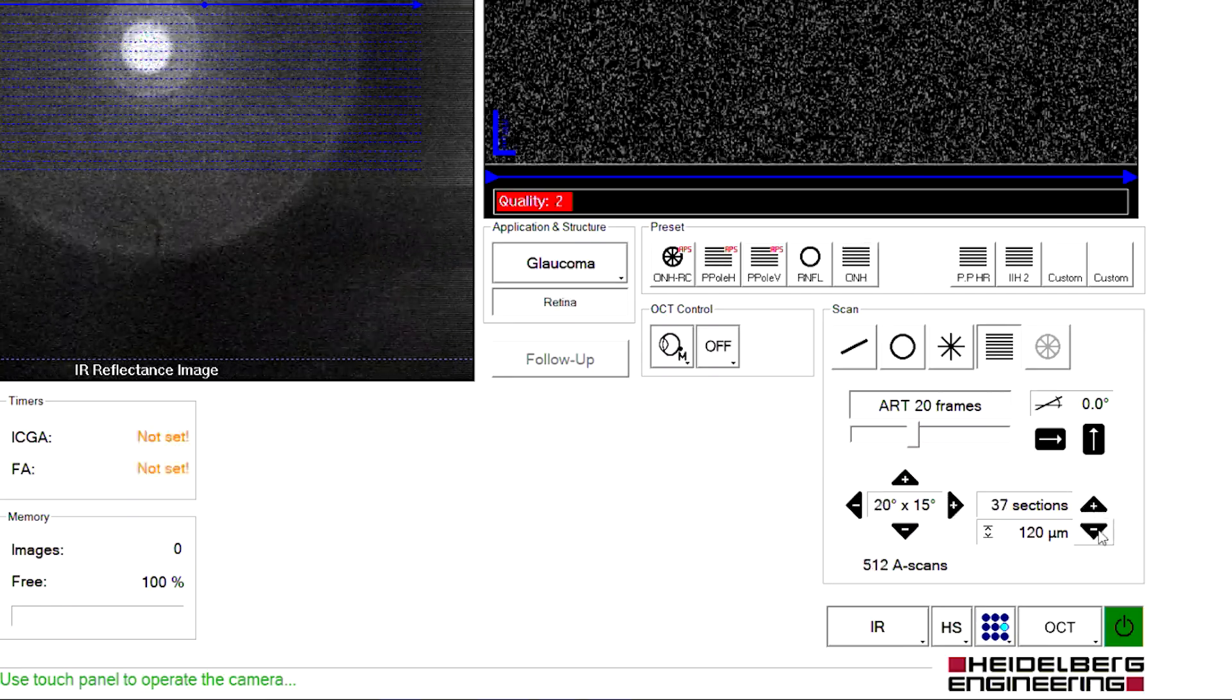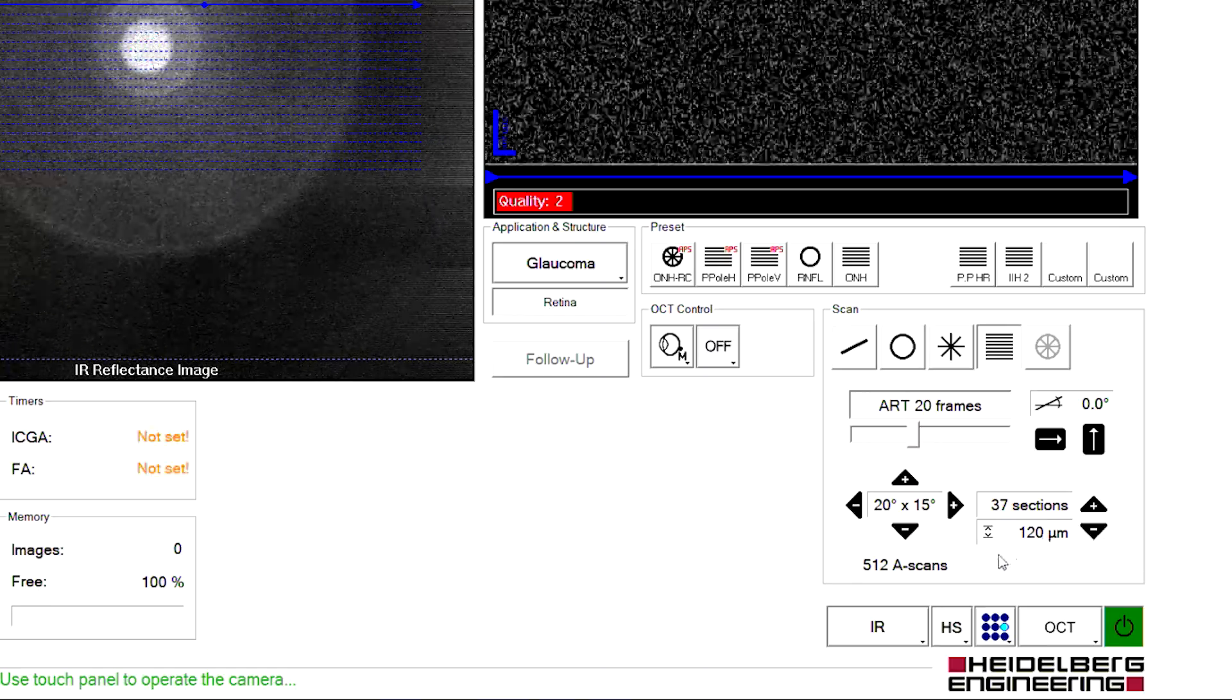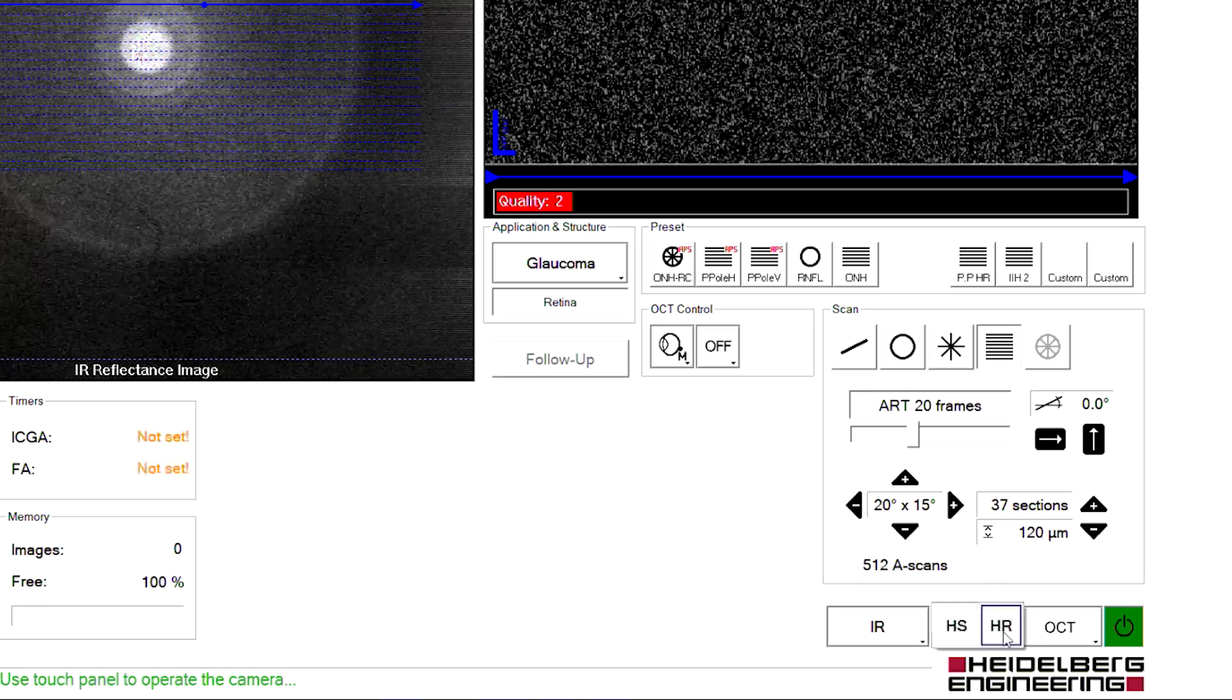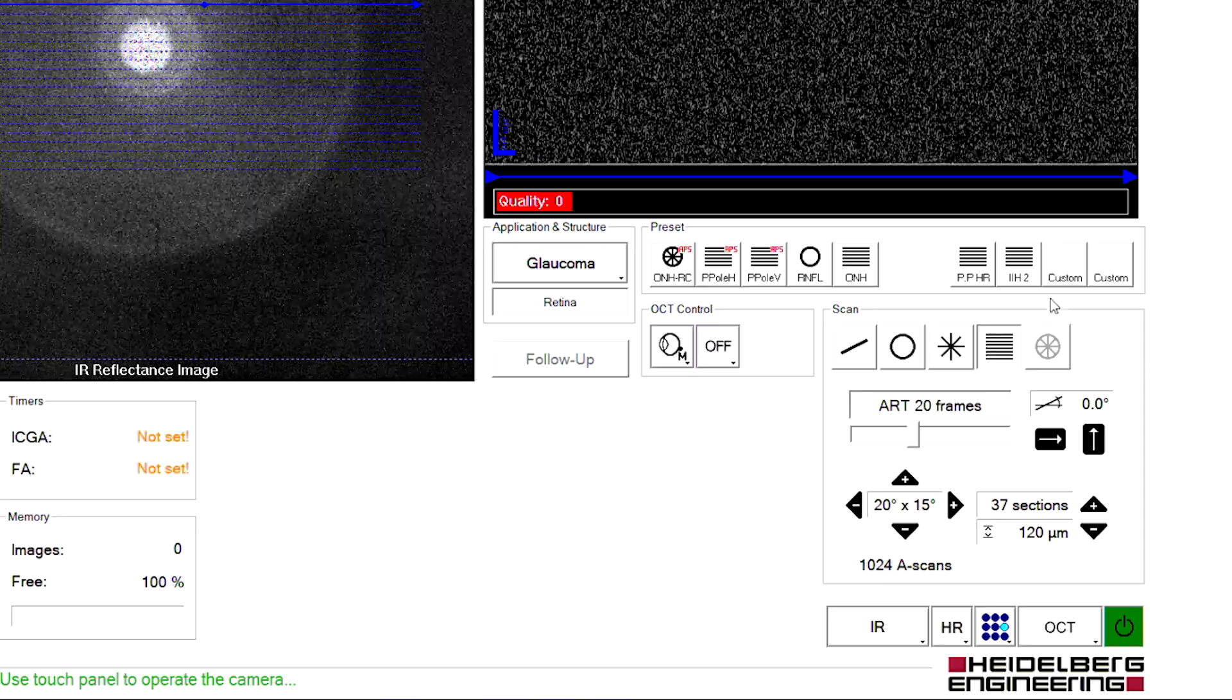To do this, before image capture, set your desired scan parameters as usual, then left-click and hold one of the custom scan buttons.